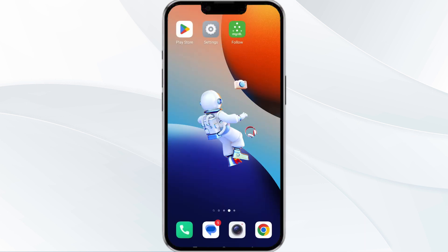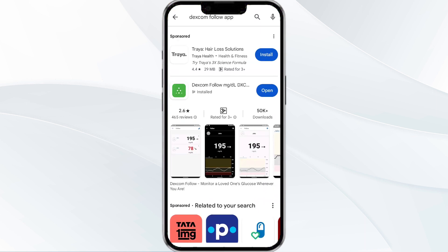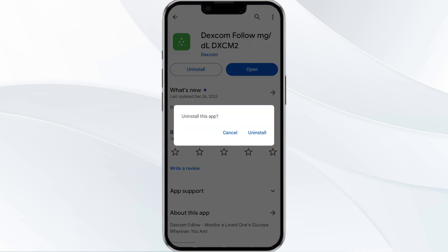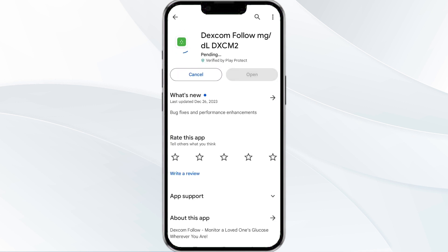The fifth method to solve this problem is to uninstall and reinstall the Dexcom Follow app. To do this, open the Google Play Store app and search for the Dexcom Follow app. Select the app and then uninstall it. Once uninstalled, tap the Install button to reinstall the app.